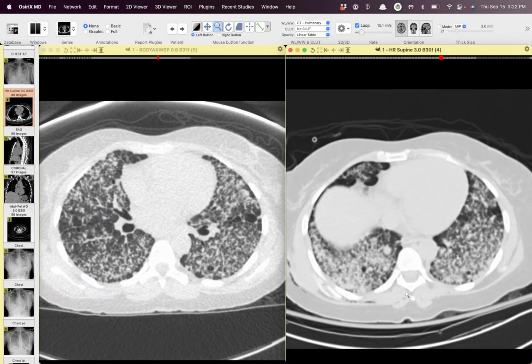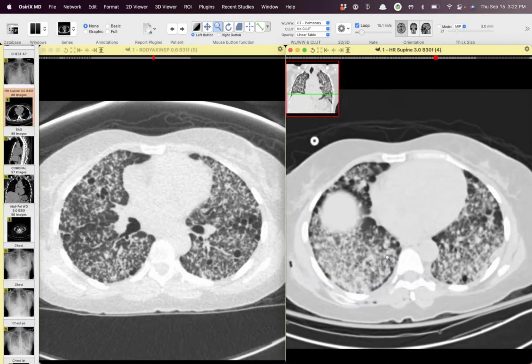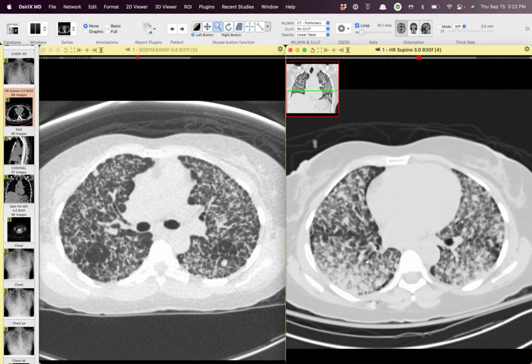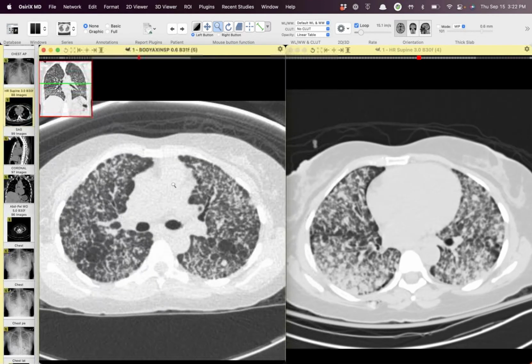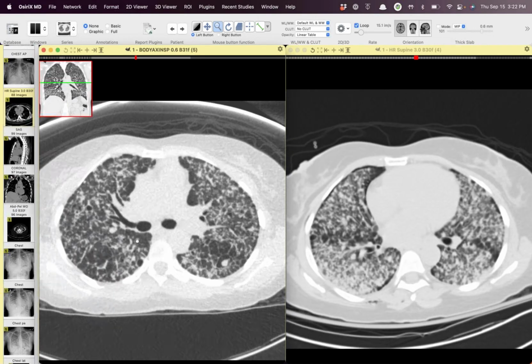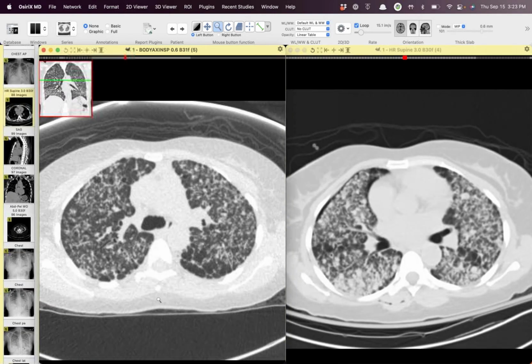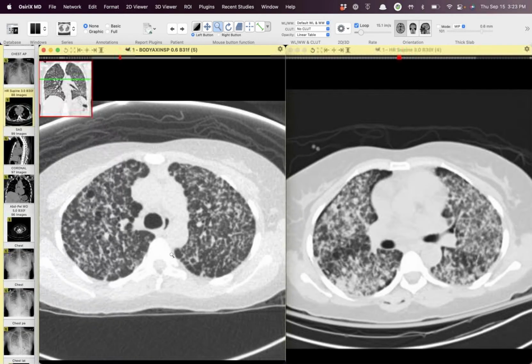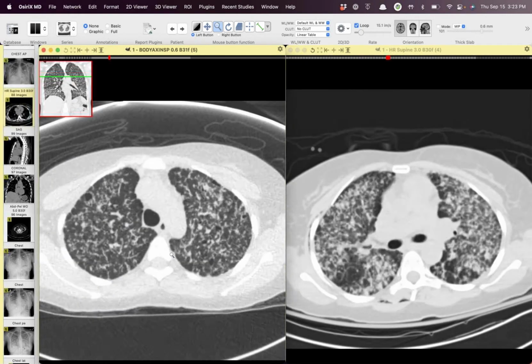Well, that was the other thing I thought too. No, this, she had a hysterectomy for fibroids. They did a transbronchial biopsy, and this was all benign metastasizing leiomyomas. Oh my goodness. Yeah, they put her on rituximab and some other chemotherapeutic agent, and she responded and symptomatically got much better. And this was 10 years ago, and she's still alive. She hasn't even had imaging here in the last few years.